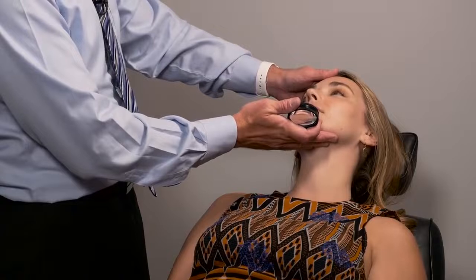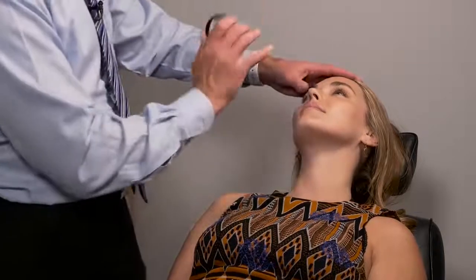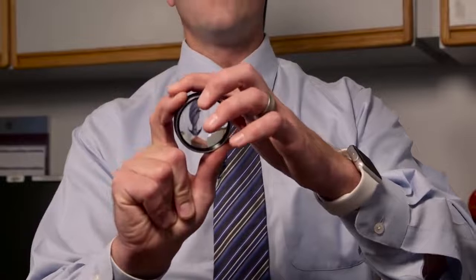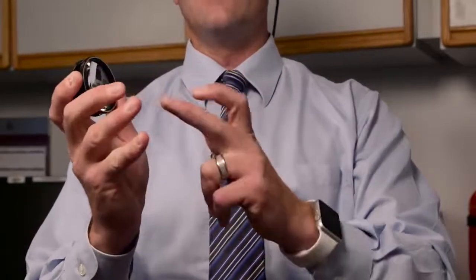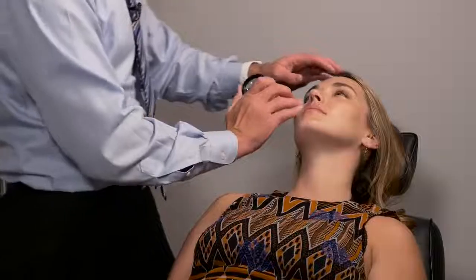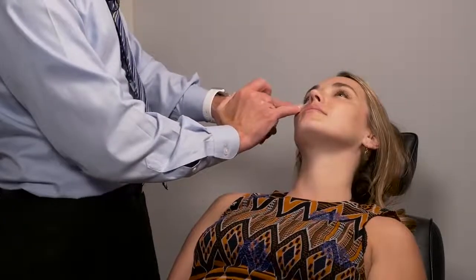I'll tilt their chin just a little bit to the left. Key concept in holding this, it's like the 78 or the 90 diopter lens: you're going to use your thumb and your pointer finger to hold the lens. You use your pinky and your ring finger to rest on the patient's chin or their cheekbone.